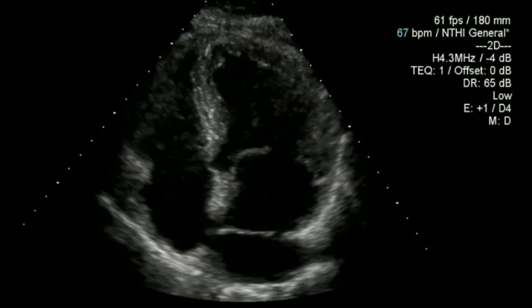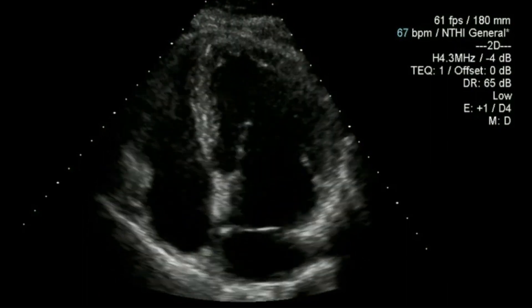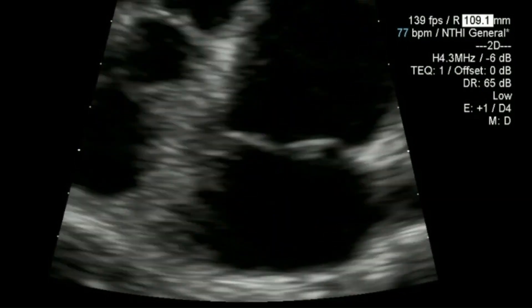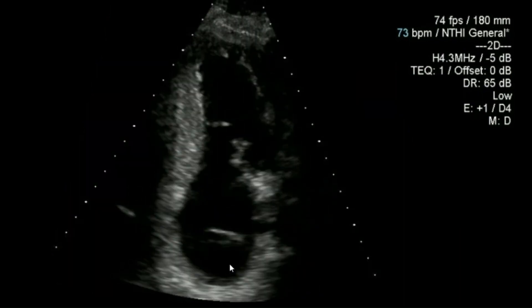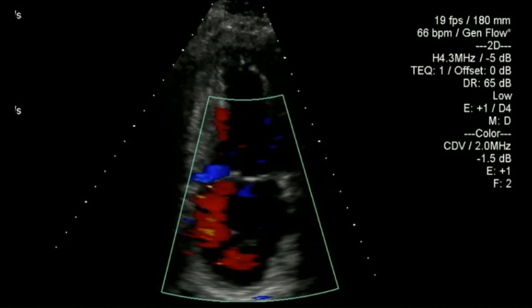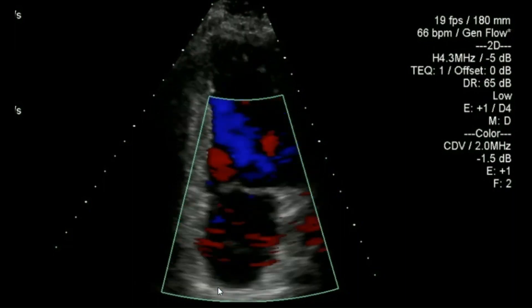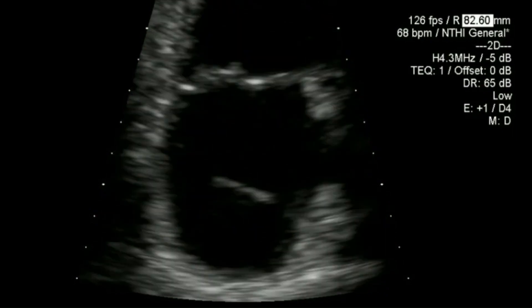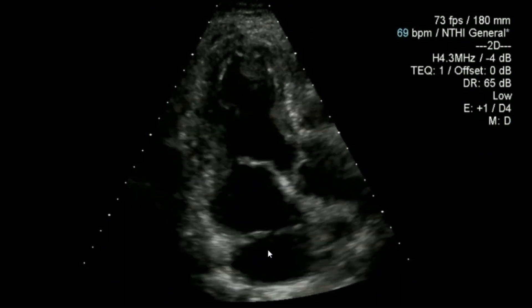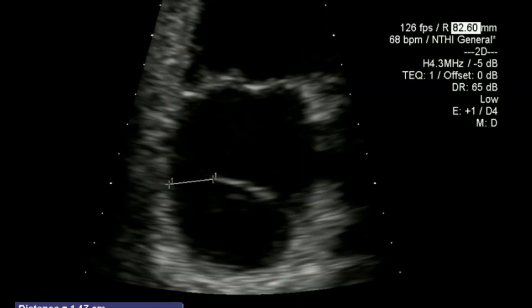The more telling view is the four-chamber view, where we see a dilated left atrium and can clearly see this membrane across the left atrium. On zoom you can see it crossing clearly — it doesn't appear particularly calcified or overly thickened. When we come around to the two-chamber view, we do have an apparent absence of membrane on the inferior side. Colour flow shows flow going across there with no flow acceleration, suggesting no particularly elevated gradient. The size of the orifice is at least one and a half centimetres.